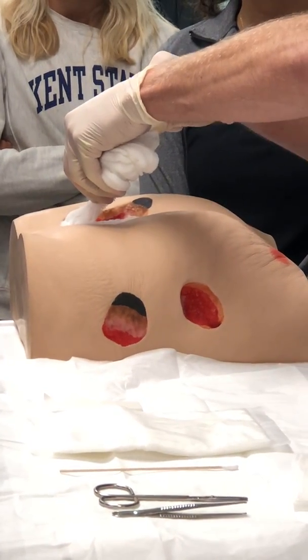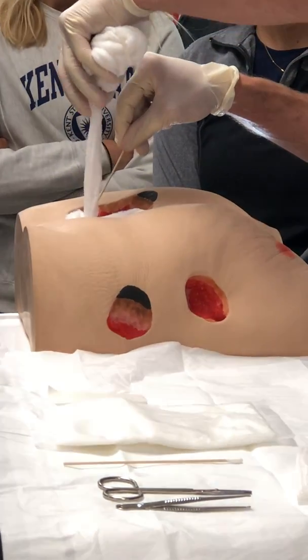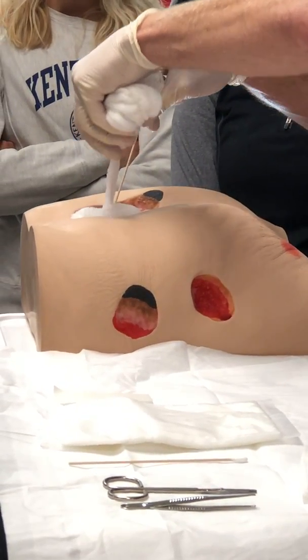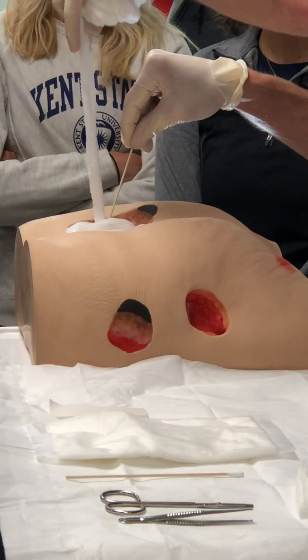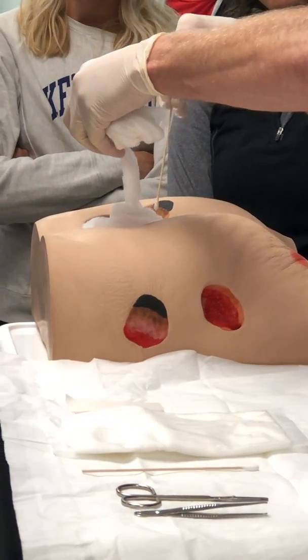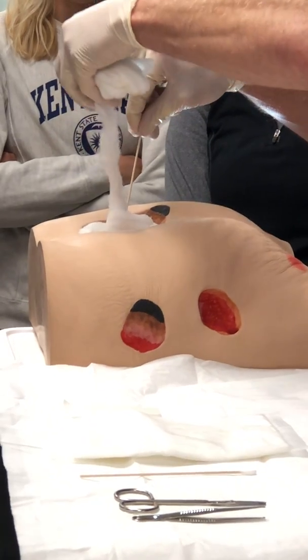I packed the tunnel first, then I did the undermine, and now I'll do the body of the wound. Could you do the undermine before the tunnel? Sure. It's no difference. Could you do the body, then the tunnel, then the undermine? You could if you could figure out how. I don't know how you would do that. It doesn't necessarily matter.